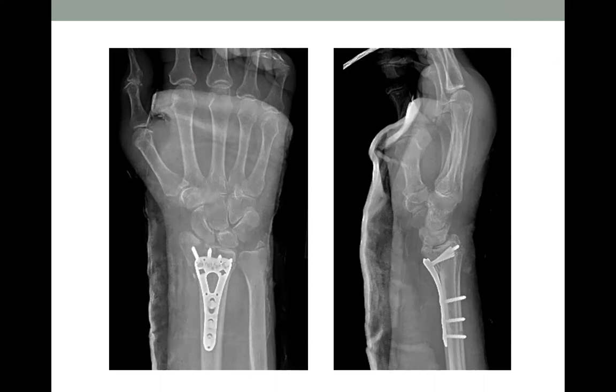Agreed. Aren't those screws variable angle? Can't you variably angle it 15 or 20 degrees? You can, absolutely. I don't think we did that for that radial styloid screw, but because we struggled with it, once we got it there, I was tempted to replace them. We had already replaced one screw because it was a little too long dorsally. I just thought well enough alone because it was stable at that point. I would splint that for at least a month because I think that's not great fixation of the styloid, even though it's perfect now.